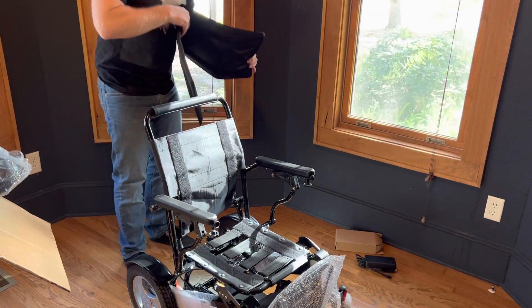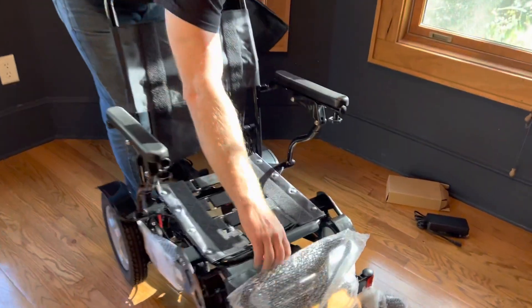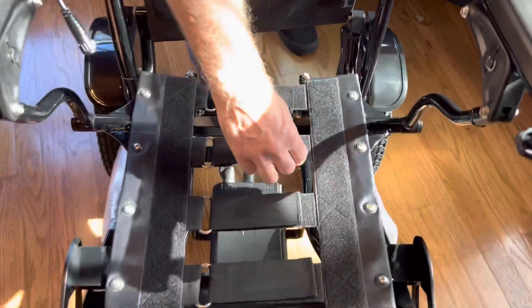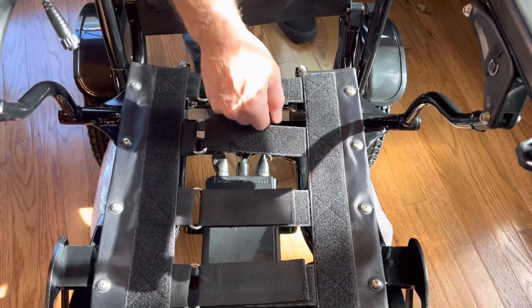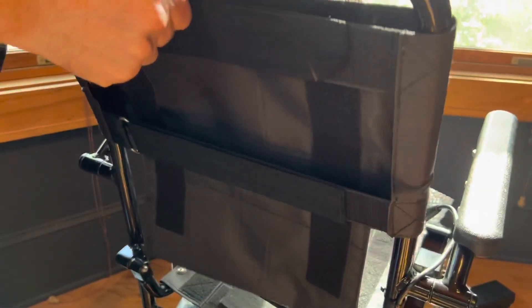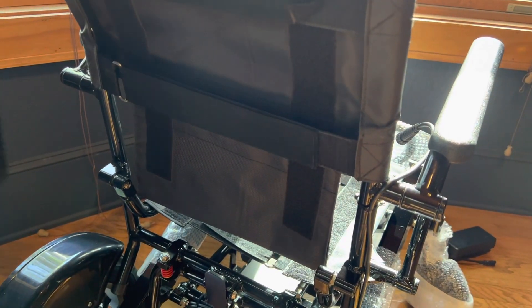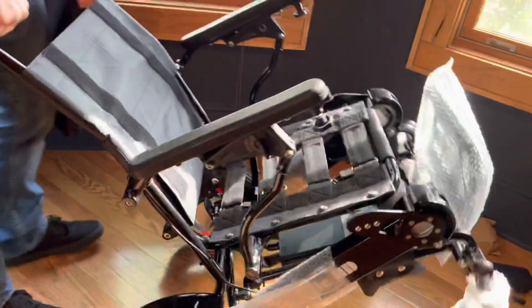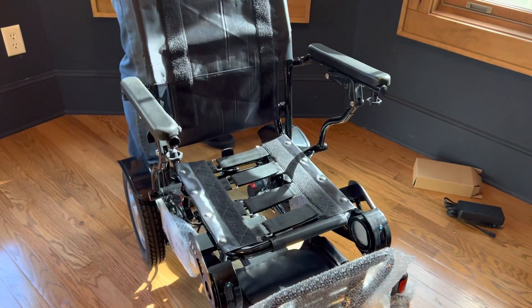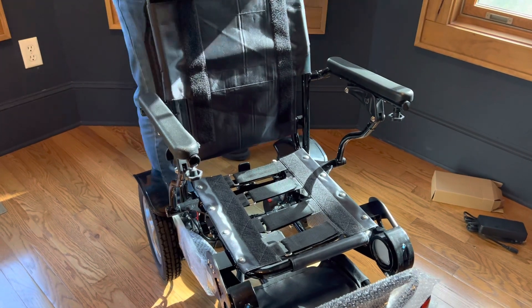Before I put the back cushion on, let's take a look at the wire or the actual seat harness here. This is adjustable — I can adjust how firm I want the seat. And if we take a look in the back here, I can adjust the firmness of the back or even the height of how far I want this back part to come up. So we have a lot of features for adjustability. I'll eventually take those off, but I just want to kind of get the chair cleaned up here.